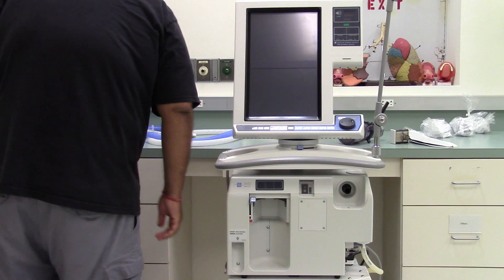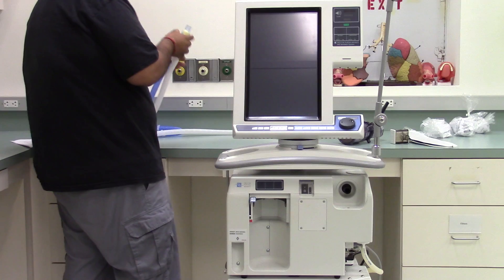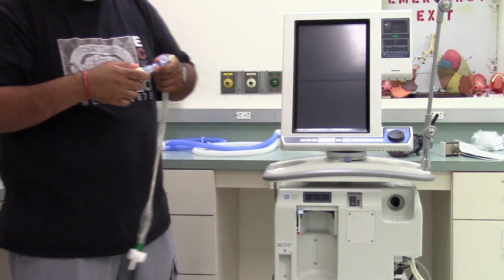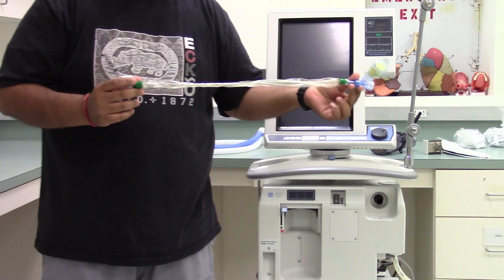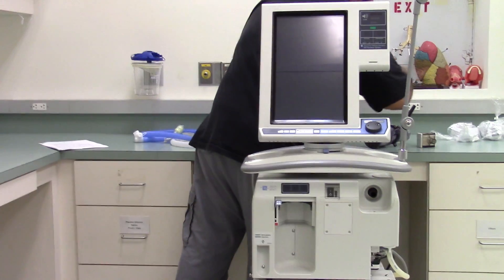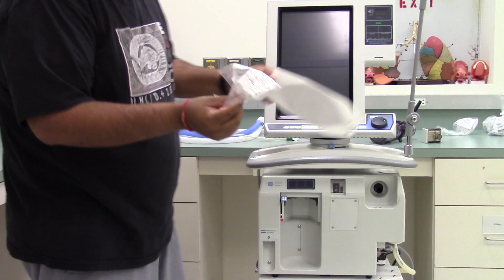You also need a circuit using an HME and inline closed suction system. This is your closed Ballard suction line system. You also need a test lung and a mouthpiece — this is our test lung and the mouthpiece.